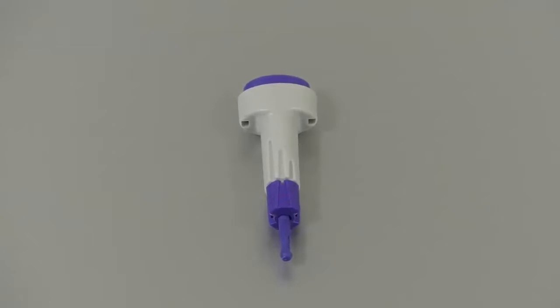In order to use the safety lancet you need to twist and pull off the end purple sterile cap. Again it's only the very end section you twist. Then when you push the button the lancet provides a quick gentle puncture before it retracts permanently into its protective case. This is important as it means it cannot be accidentally reused.